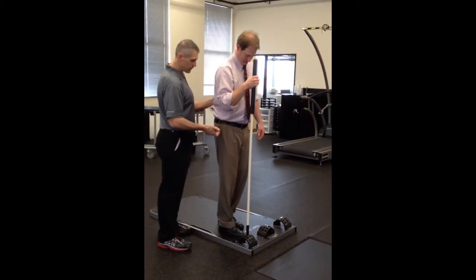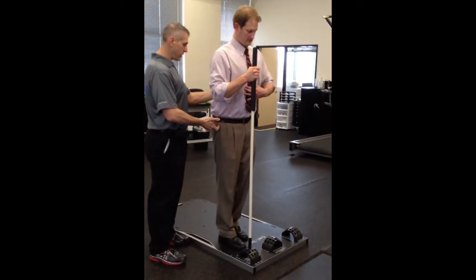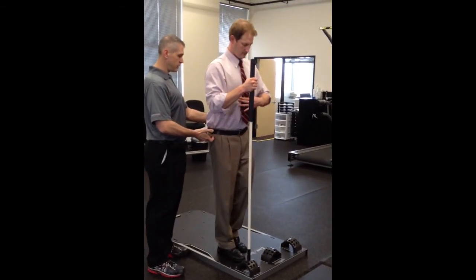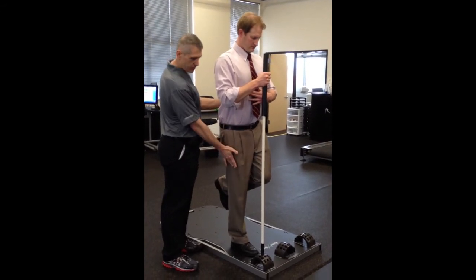Staying a little closer — that's it, good. Stand up tall on this right hip, good. Stand nice and tall, other foot off the ground — that's it, standing up tall. Good. Push to the arch of the foot.